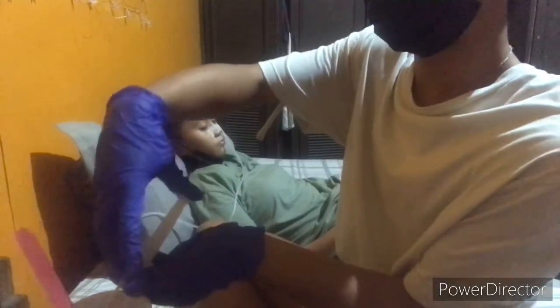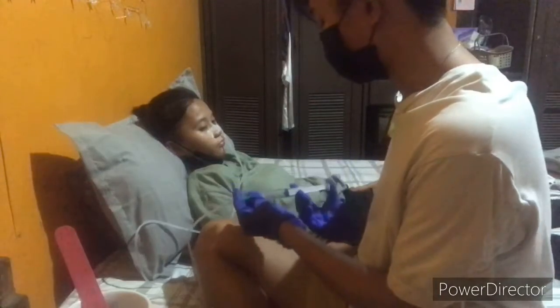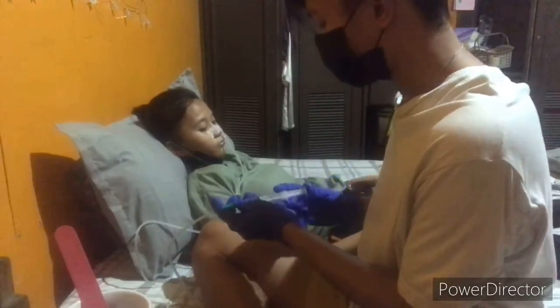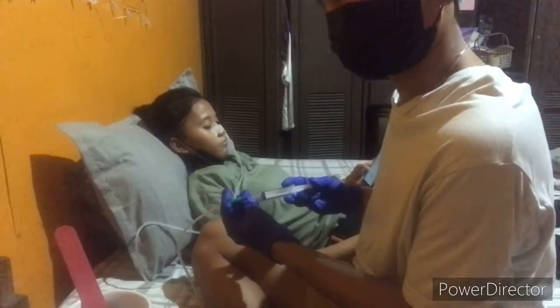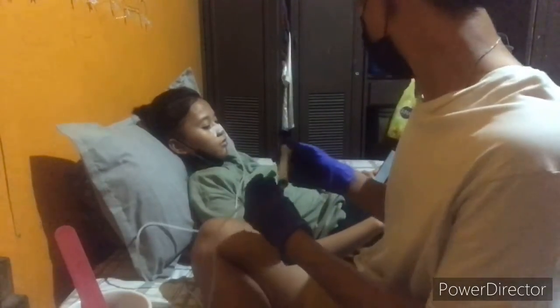Initiate feeding. Bolus or intermittent feeding: pinch the proximal end of the feeding tube to prevent air from entering the client's stomach. Continuous drip method: hang feeding bag and tubing on IV pole. Continuous feeding method is designed to deliver a prescribed hourly rate of feeding. This method reduces the risk of abdominal discomfort.